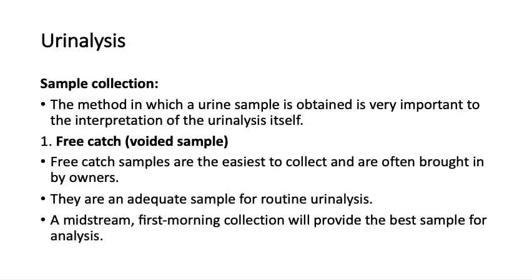To continue with the veterinary laboratory procedures, we are going to talk for today about the urinalysis. The method of collection should always be noted on the urinalysis requisition at the time of analysis. Free catch or the voided sample is an adequate sample for routine urinalysis, but it is not appropriate for bacterial culturing. Owners can be instructed on how to collect samples at home in a manner that still maintains adequate quality control.